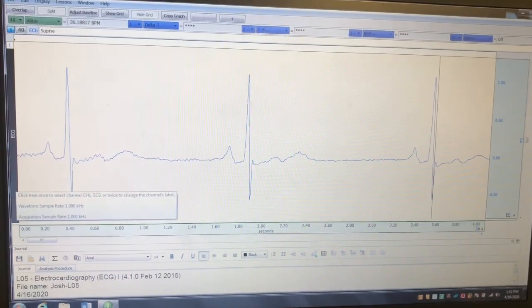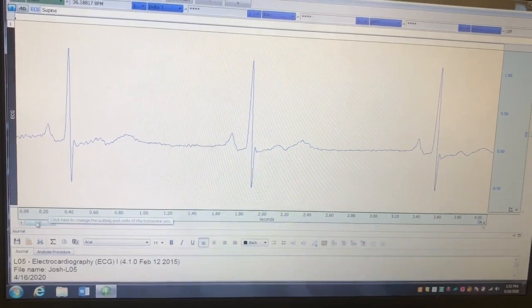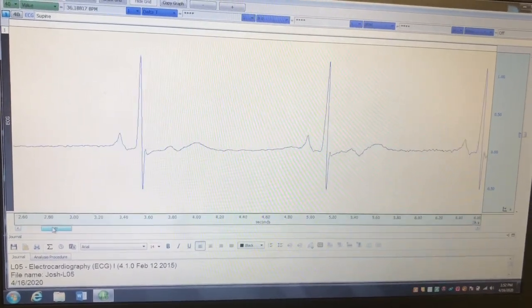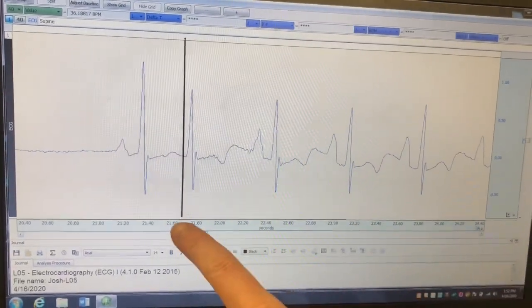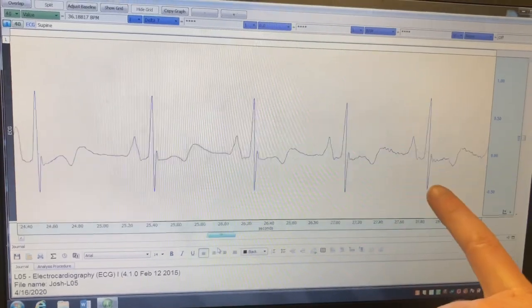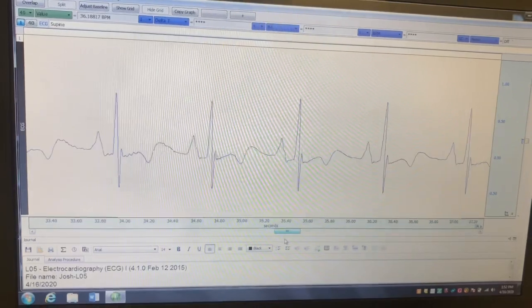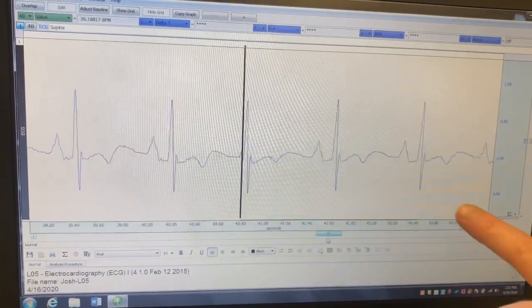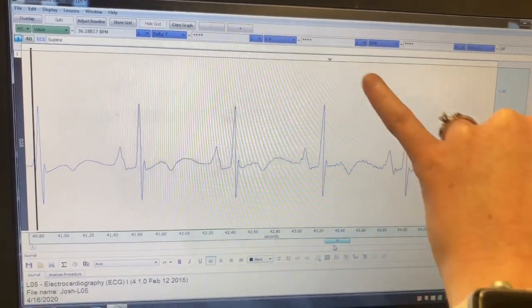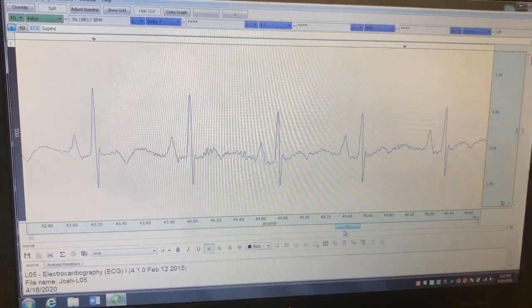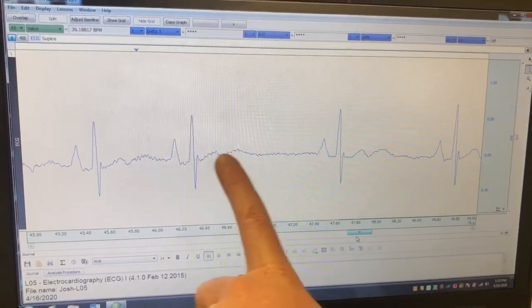We just did the protocol where he was resting, so you can see this is the data. This is a pretty normal ECG. Right here is when he was laying down, when he was resting. Right here is when he was sitting up normally, so it got a little bit faster, probably because he had just stood up. Right here is when he was breathing in and out — this point is when he inhaled and this point is when he exhaled.